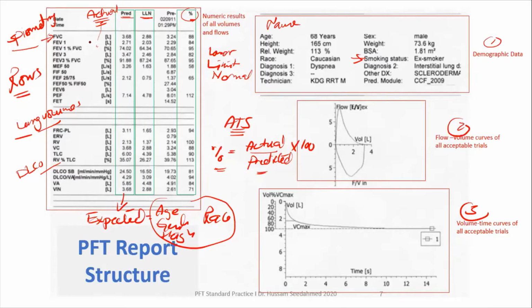Okay, we said also we calculate the percent predicted. Now the percent predicted, how do you usually measure it? It is the actual that is measured in the patient divided by the predicted that is known. For example, for the Sudanese, it is already known. There are tables for it. So the predicted, you can go to the paper and you can see it.